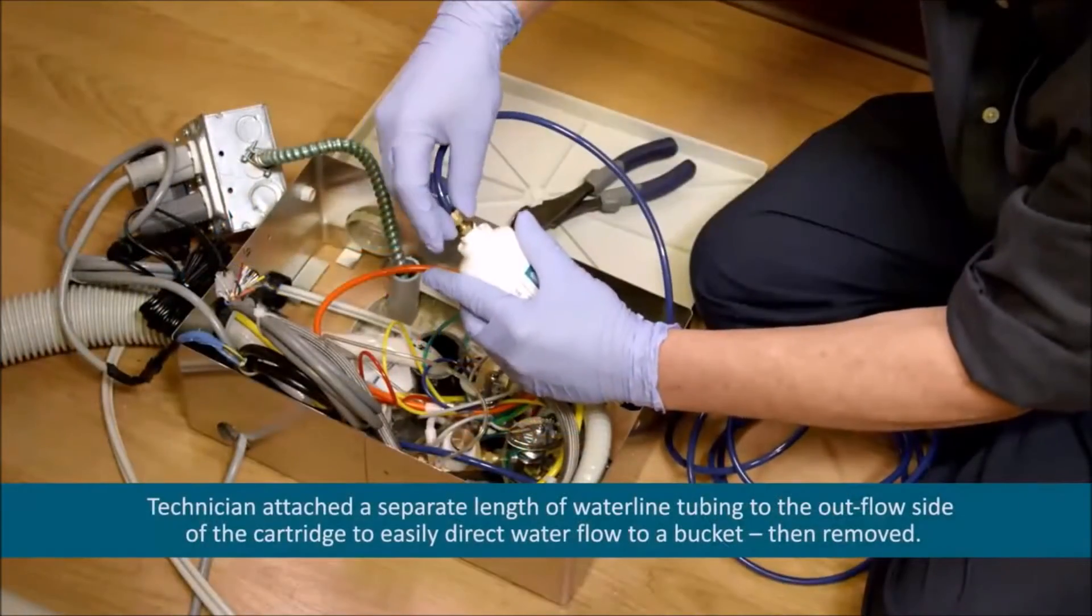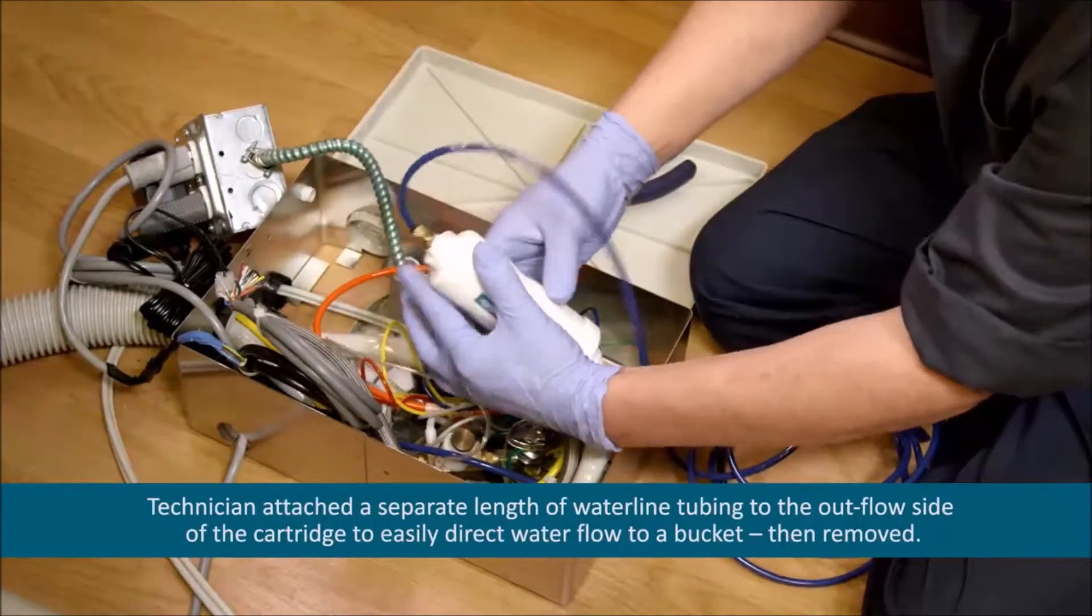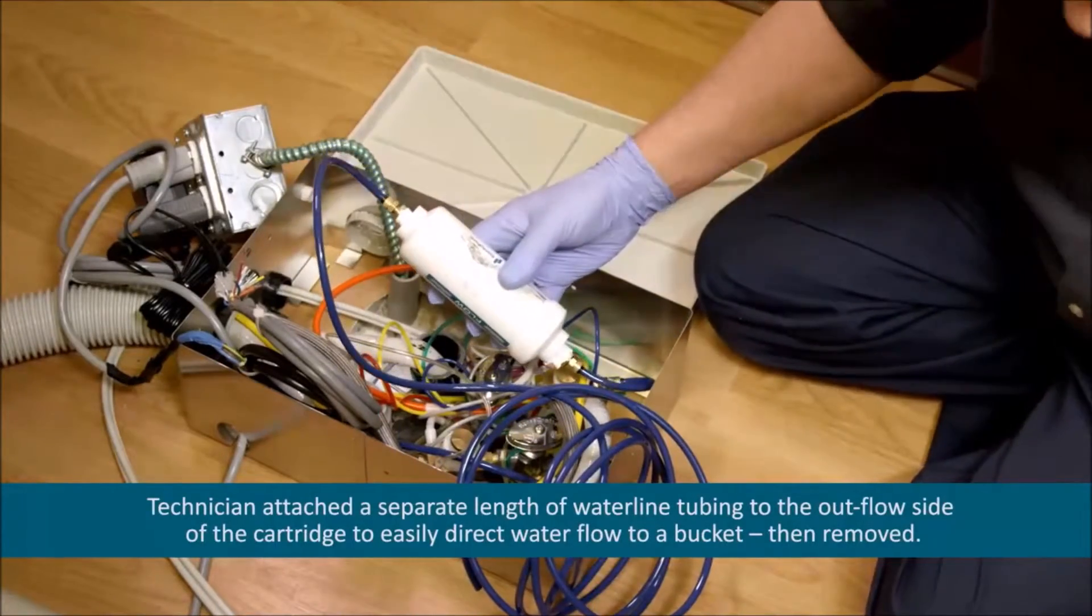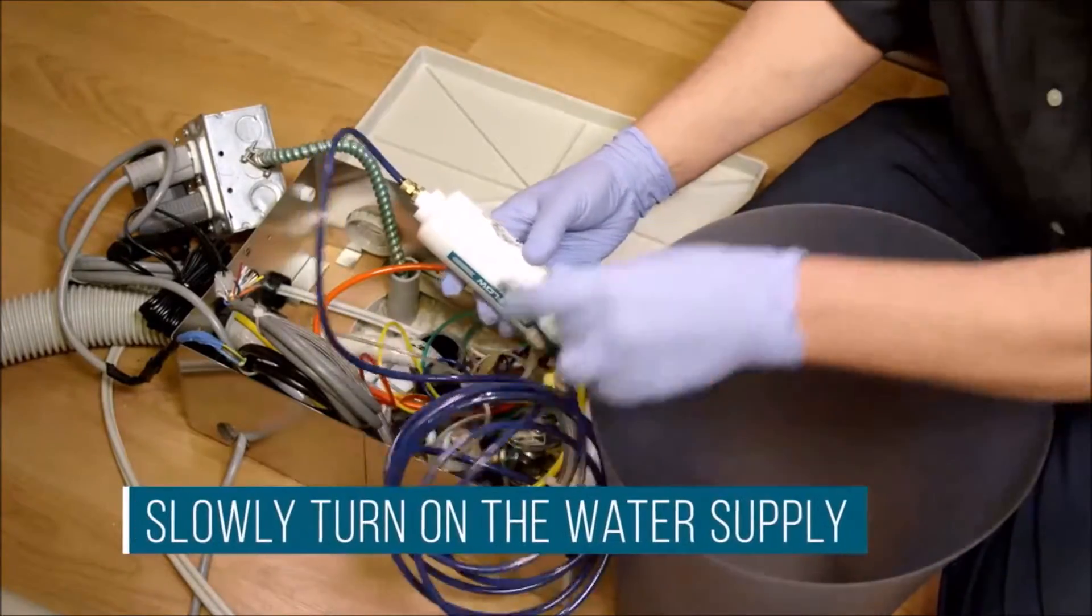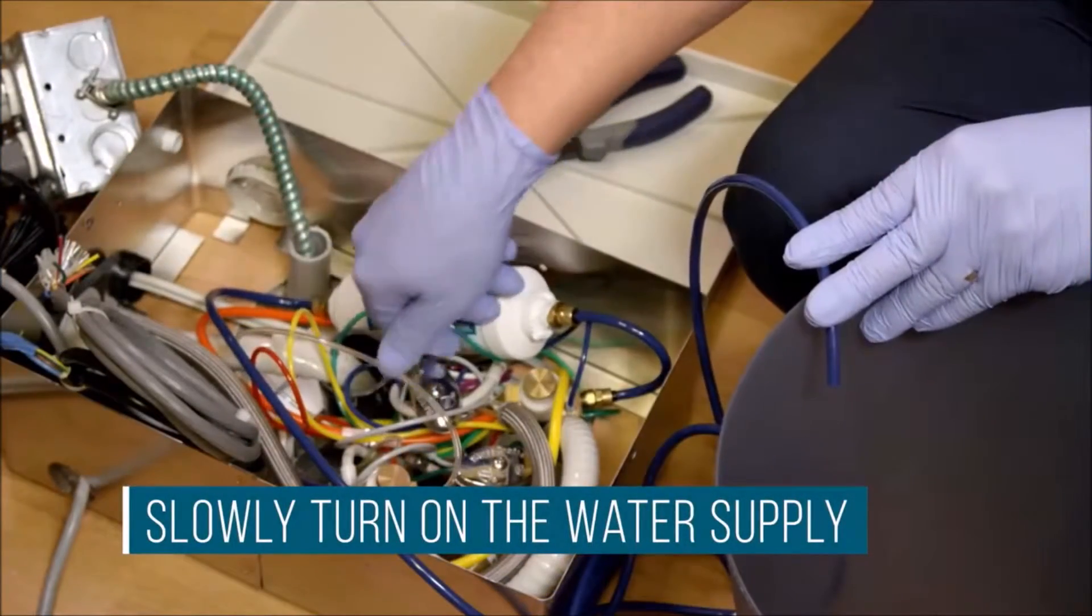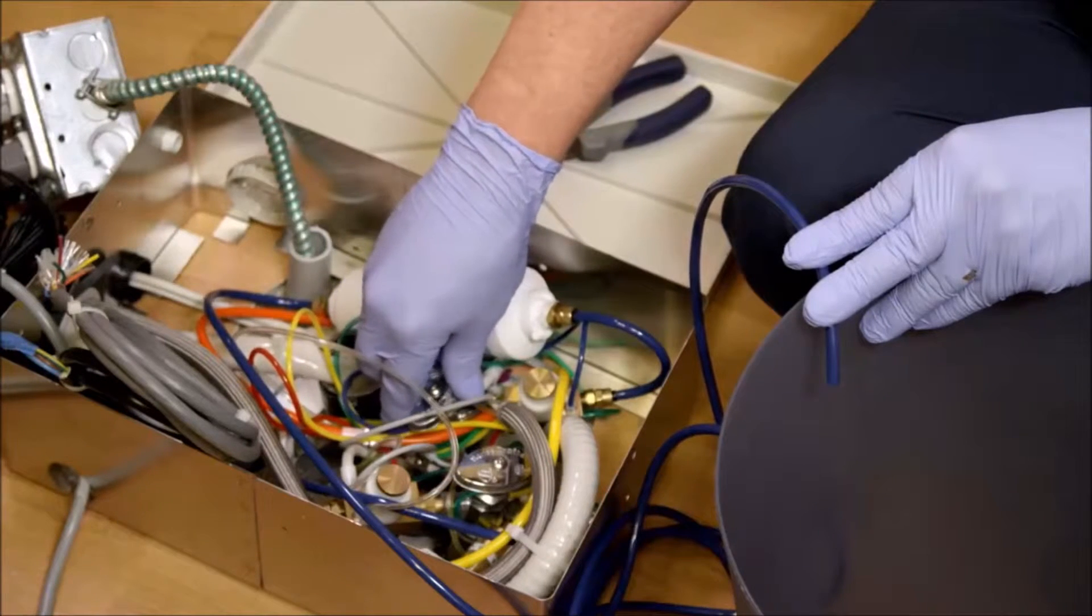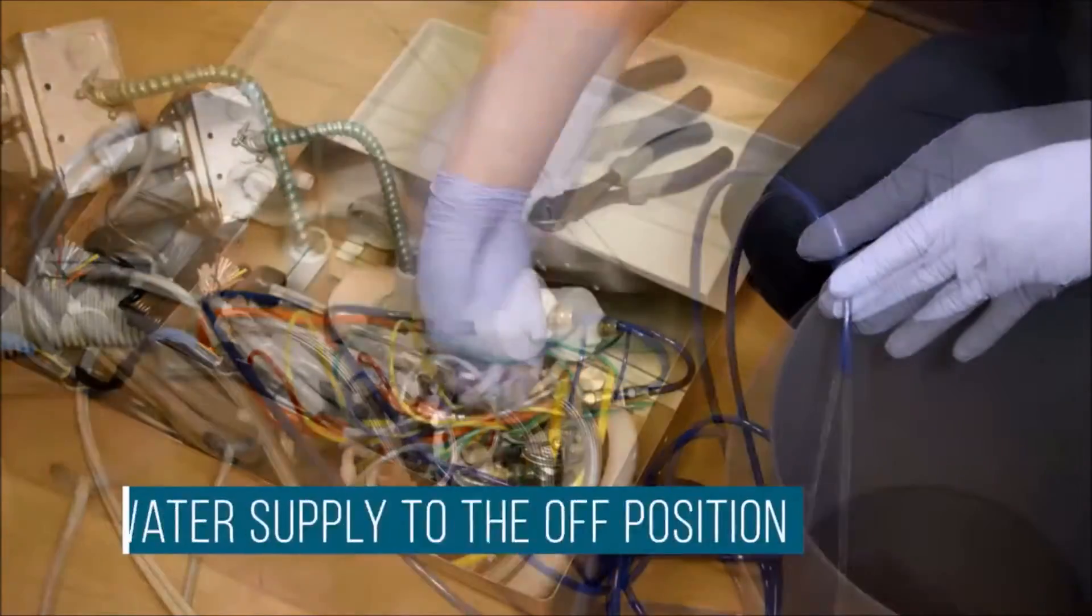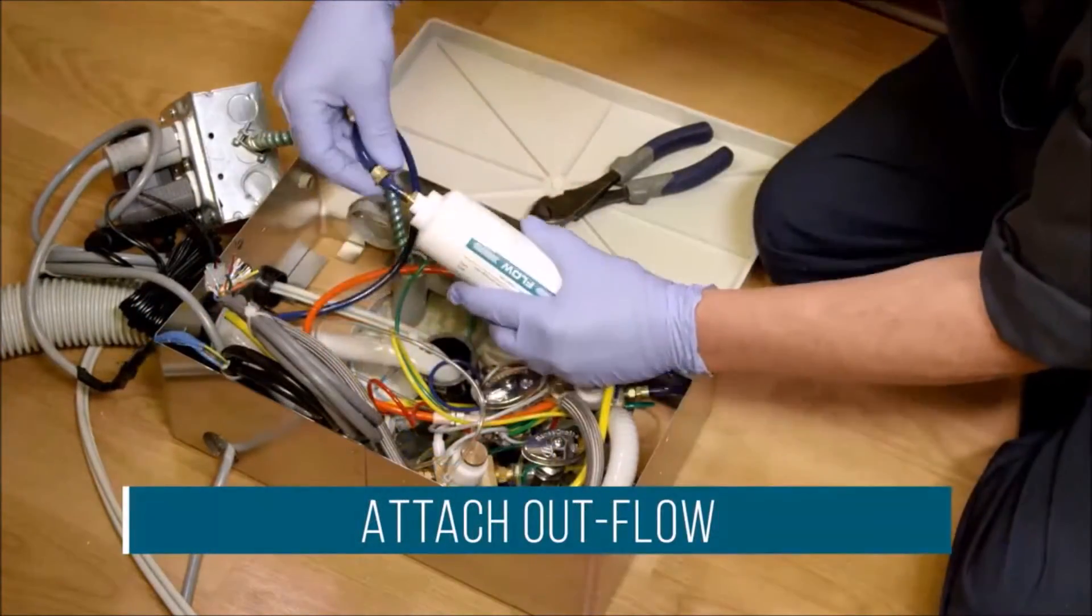Prior to installing the outflow side, you'll need to run water through the cartridge to purge air and remove any extra carbon particles. This will prevent the particles from entering the dental unit. To do this, slowly turn on the water supply until water is flowing through the cartridge. You should see the particles clearly and they will dissipate quickly. Return the water supply to the off position and attach the outflow side of the cartridge.